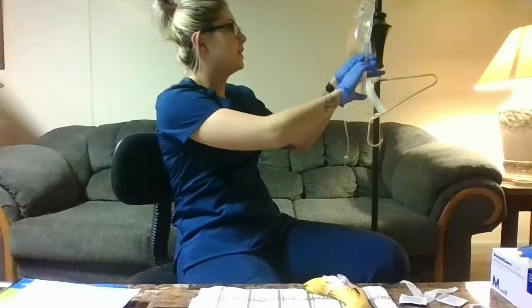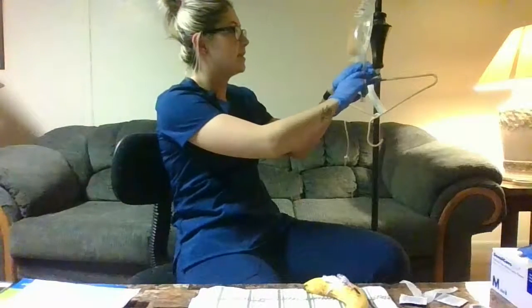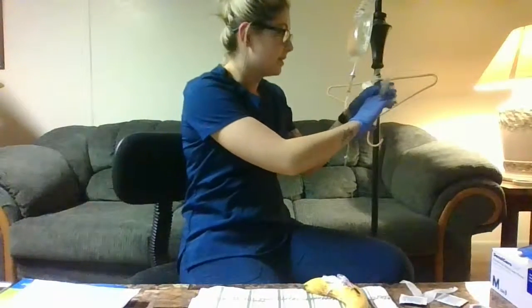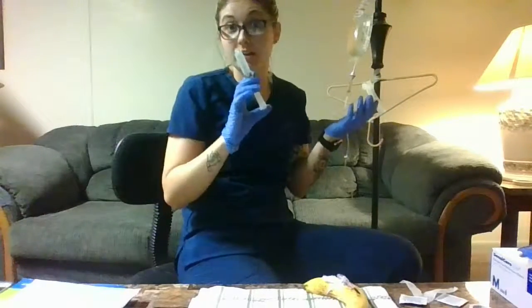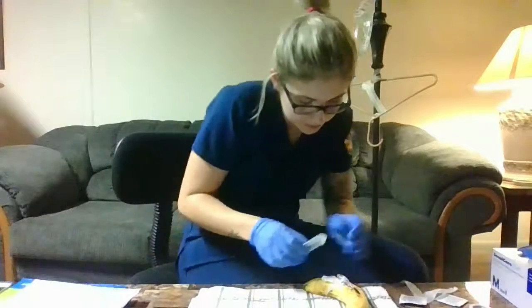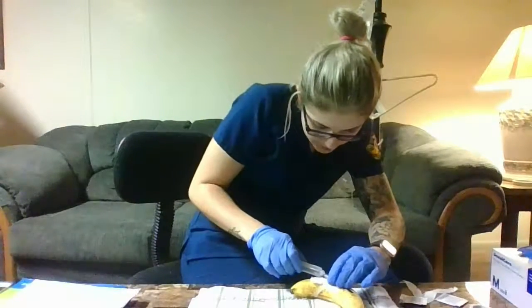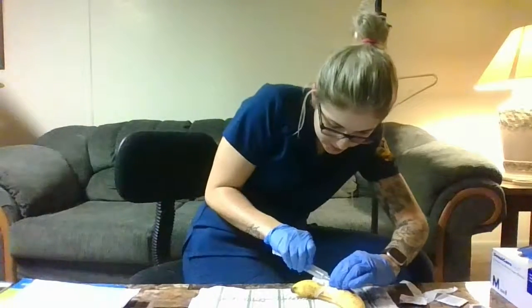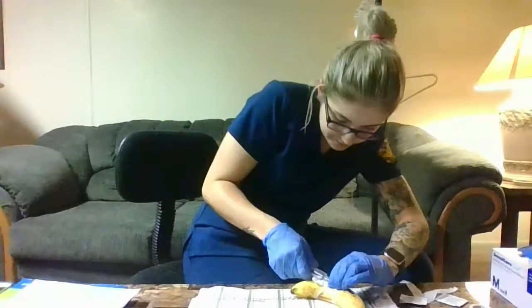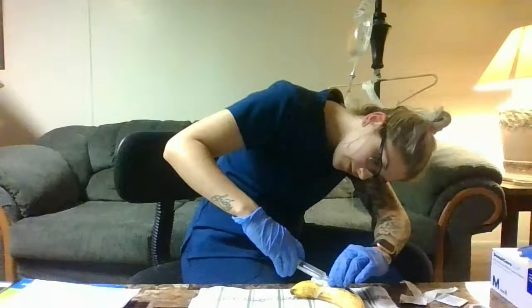Make sure that you get all the air out of the top, and there's a little bit of water that comes out, so you got all the air out. Okay, then you're going to flush. You're going to connect it, twist it, and you're going to flush 5 milliliters.